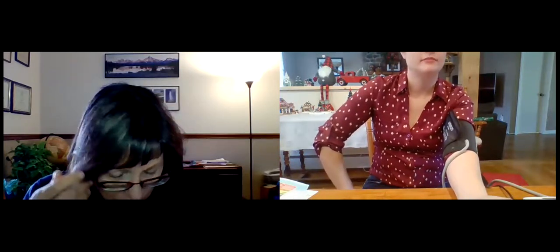99. Perfect. And then the bottom number, the diastolic, what is that? 69. Okay, that's a good blood pressure reading, Danielle. All right, so you would write that down. But you can just practice it right now. So you've gotten one reading, but remember, how many times are you supposed to take it in the morning? Twice. Exactly.